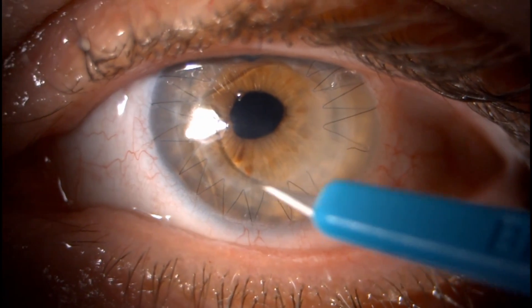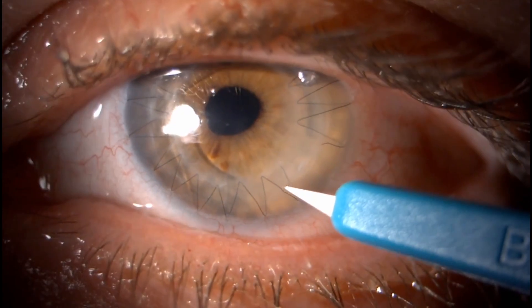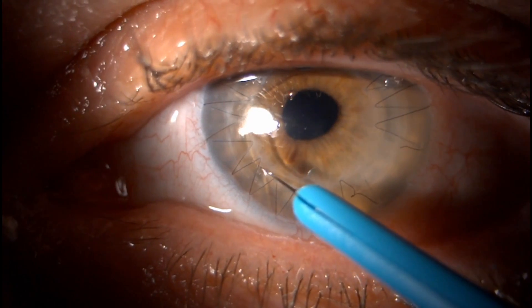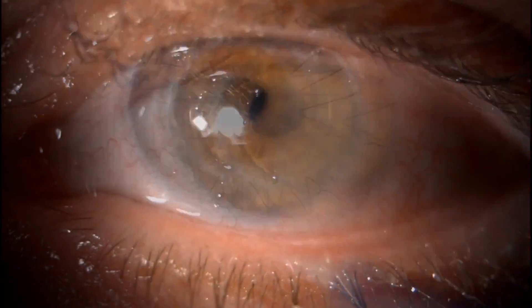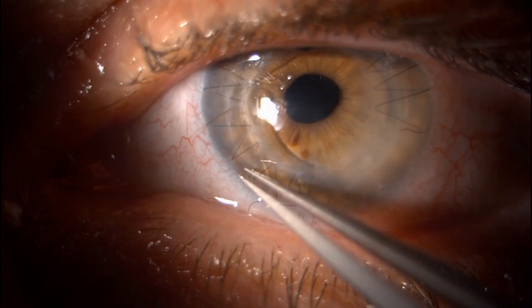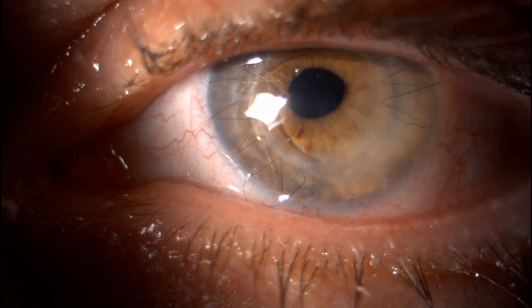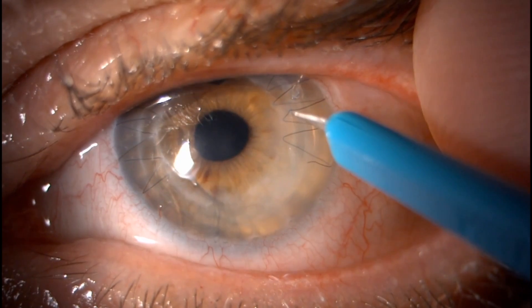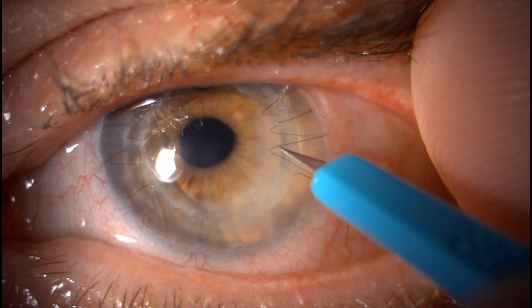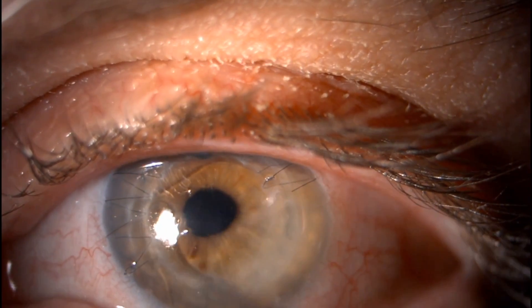Let's take a look at this at the slit lamp. Here's a patient with a broken running stitch, and it's broken in a few different spots. Remember, the suture goes through the stroma, over the epithelium, then through the stroma and over the epithelium over and over again. What you're going to want to do is use the sharp part of your needle or cutting blade and cut about every other over-portion of the suture, then loosen up the middle and pull it out. You need to go around the cornea several times cutting and loosening these stitches. We're cutting with the cutting blade and then loosening the suture in between the two cut areas, then coming back with the jeweler's forcep or tying forcep to remove that segment.